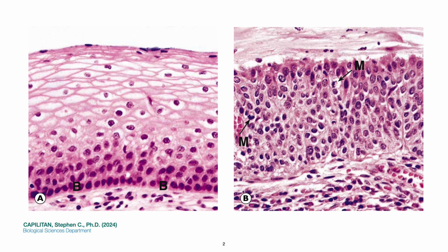In contrast, letter B will show you a dysplastic cervical epithelium, where there is a disruption of the normal orderly maturation sequence. Cells in all layers now exhibit, as you can see, larger than normal nuclei, some with prominent nucleoli. Mitotic figures may be seen in letter M, well above the basal layer.